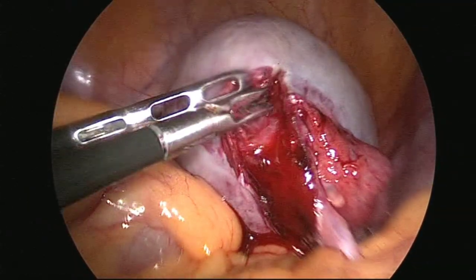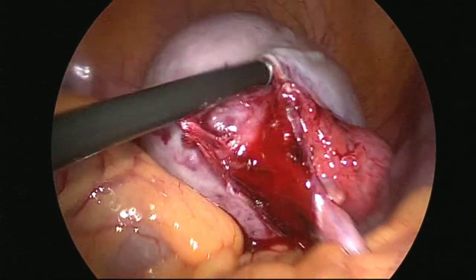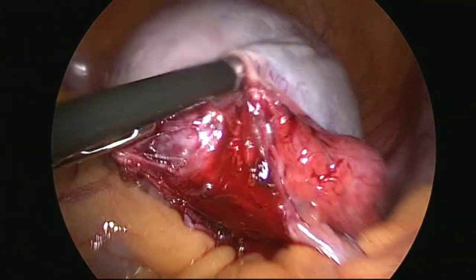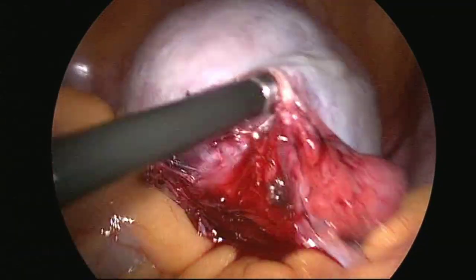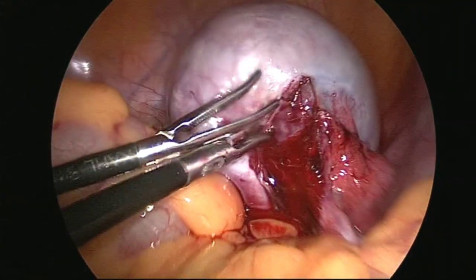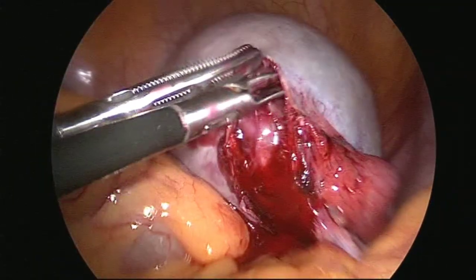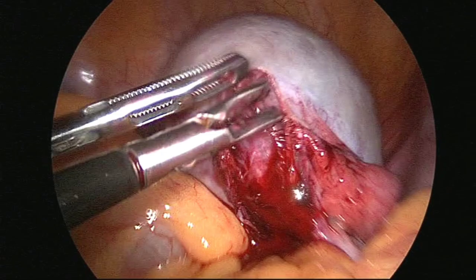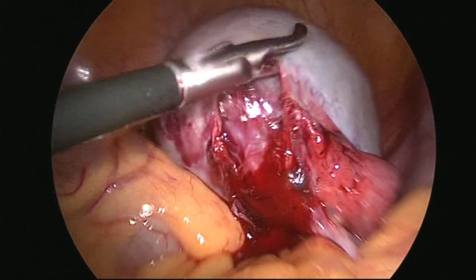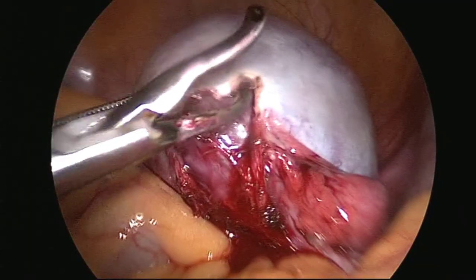I'm trying to avoid the puncture of the cyst, because if I puncture the cyst, then it is too difficult to separate the cyst wall from the healthy ovary tissue. It will create a lot of problems. So my main motto is to enucleate the cyst completely, then I will aspirate.